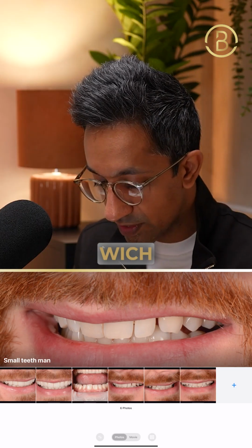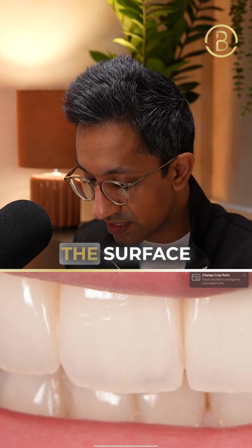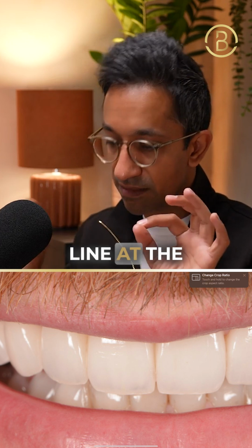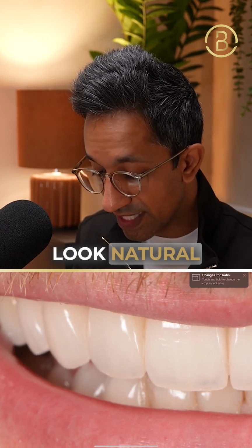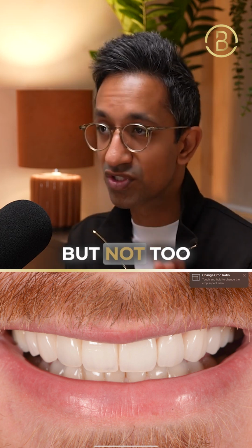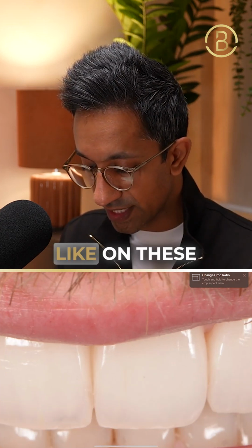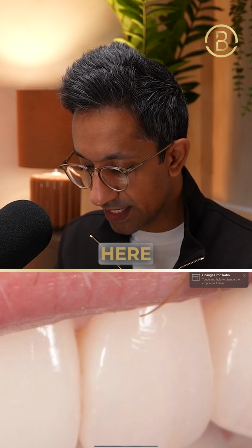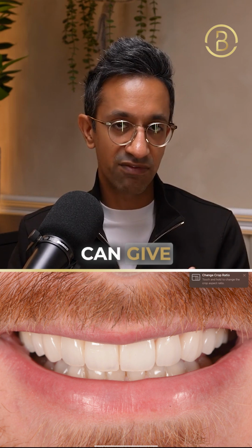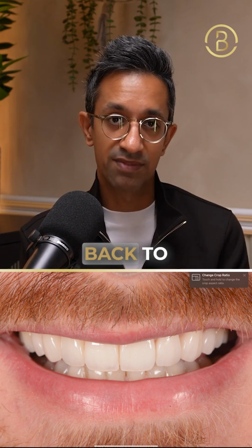When we design a tooth, which the final result is here, what I will do is put translucencies into the surface at the bottom. I will create a halo effect, which is the tiny line at the base of the tooth, which allows it to look natural, mimicking nature. The surface texture is a little bit uneven, but not too uneven. And it means that we get light reflection in specific points on the tooth, like on these lines here, you see it here. That distracts the eye from seeing the width that's been created. And that's how we can give people physical size and volume and the size of the teeth they need, and then scale it back to make it look smaller.